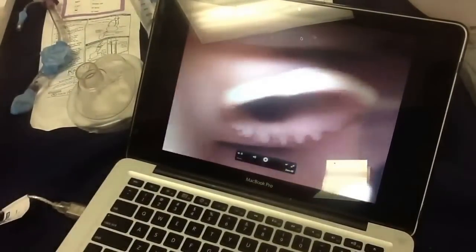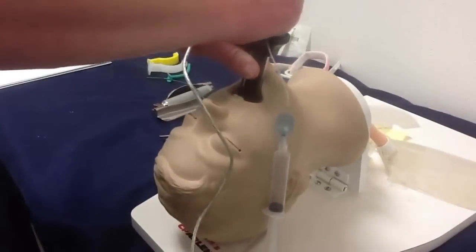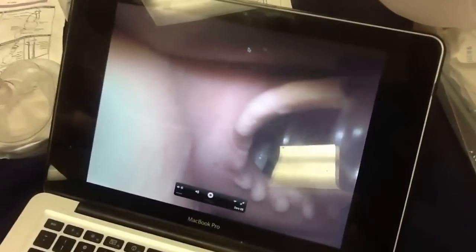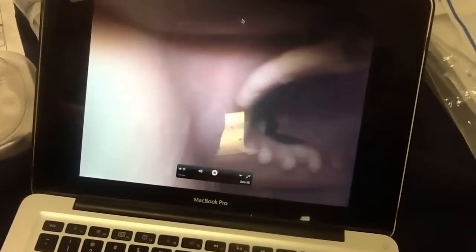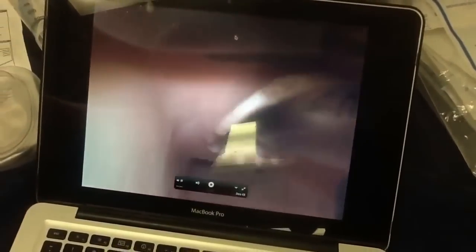It's basically like a cheap GlideScope. You can manipulate the airways around — clearly you can see the cords. And then basically you just advance the tube off. You can see as it's passing through the cords. Black ring.